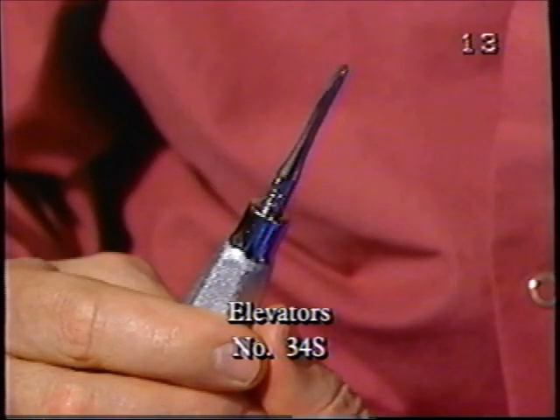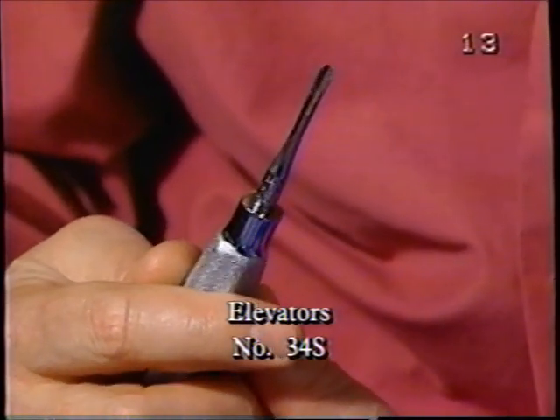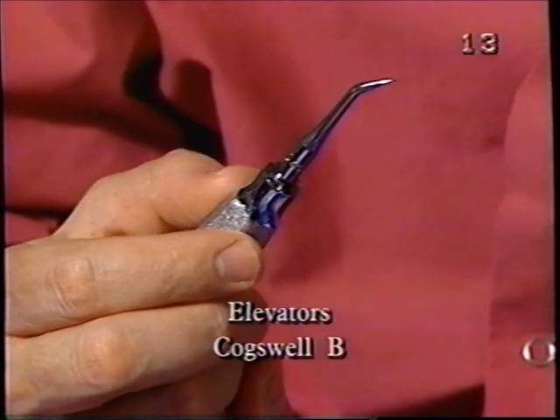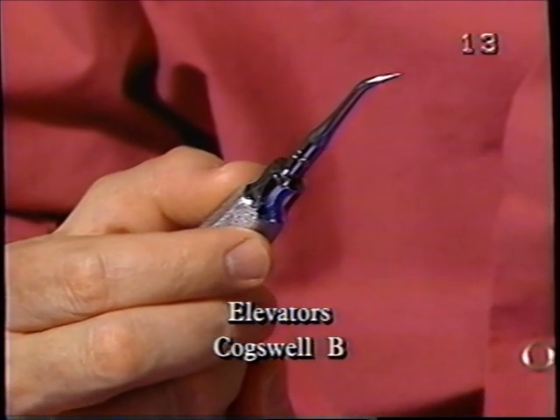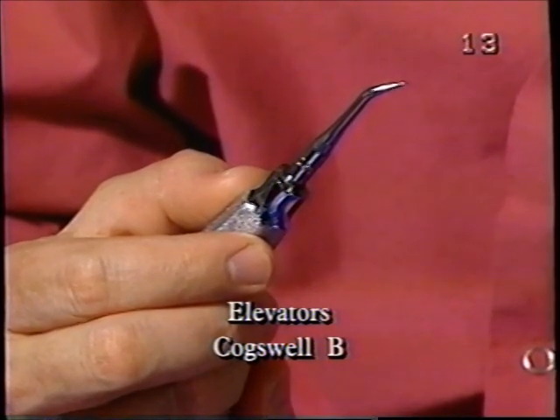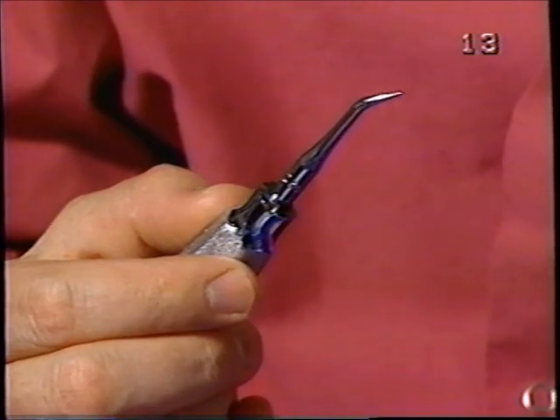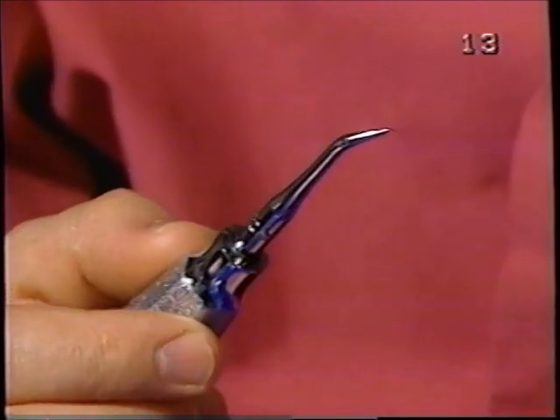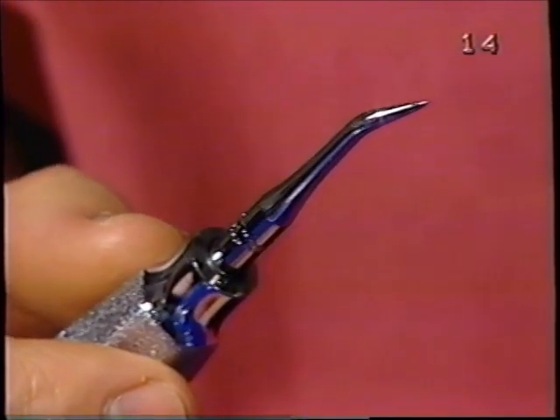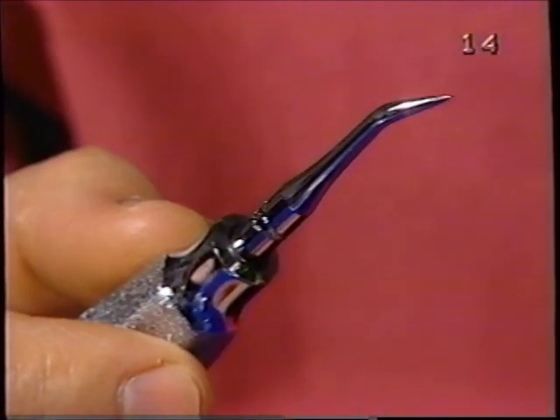But there are times when you need one that's a little bit wider, and that would be the 34S as one example. This is called a Cogswell B, and it's similar in its angulation to a crane pick. It's used to put into purchase points, which are holes in the root or the tooth adjacent to bone. It allows good leverage, once it's in that purchase point and fulcrumed against bone, to be able to cause the withdrawal of teeth or roots.